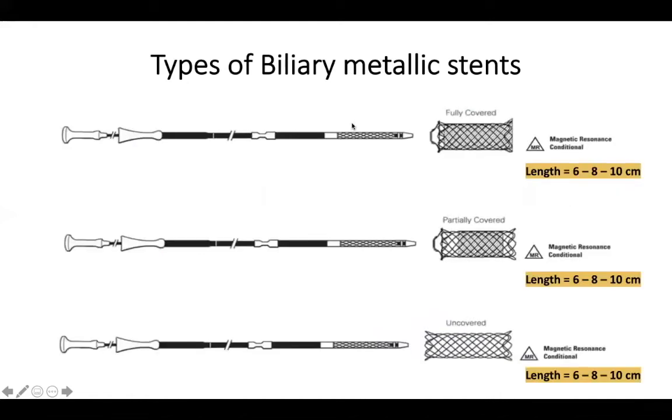Regarding these stents, the covered stents have another advantage because they are removable, and there is a lasso at the distal end that facilitates retraction of the stent when removal is indicated, while the uncovered stent has no lasso because it is unremovable.